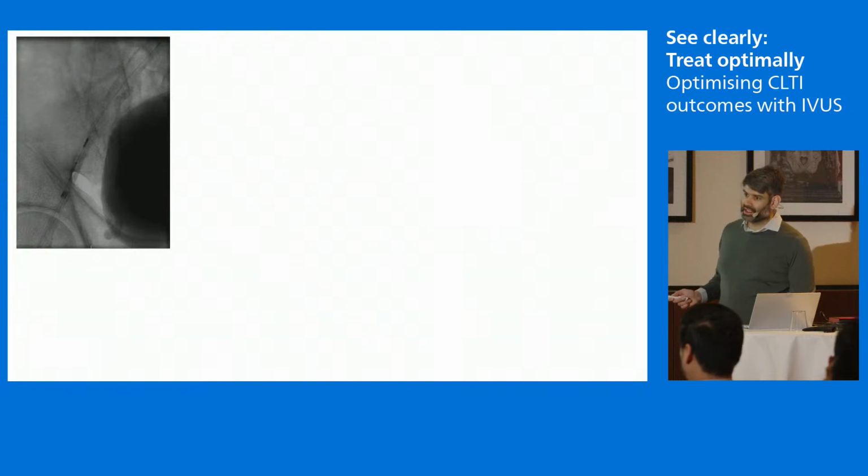There was some disease in the left common femoral artery and SFA, which meant that we couldn't go antegrade in the left leg. His arteries were also quite small on CT, so we decided to just use IVUS guidance for as much of the first part of the procedure as possible to minimize the contrast load rather than doing angiograms here. So you get access on this side, wire up, IVUS in and mark positions.